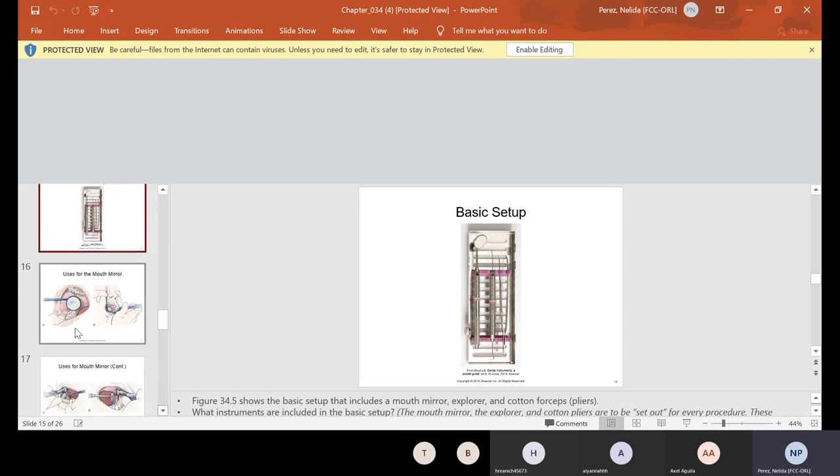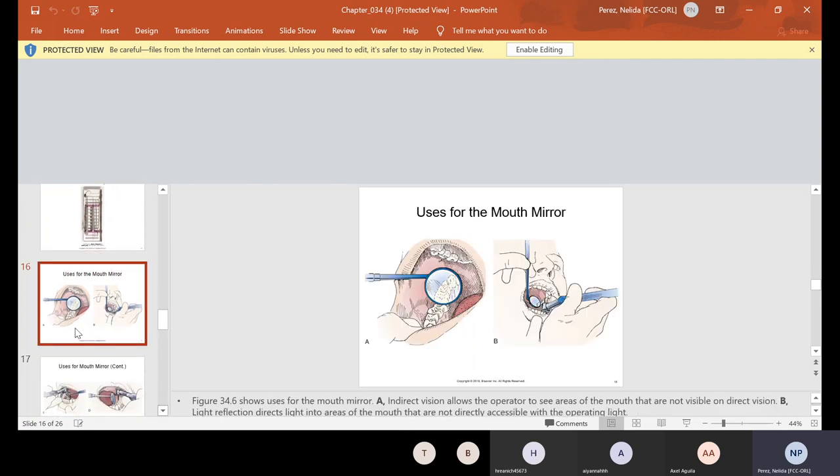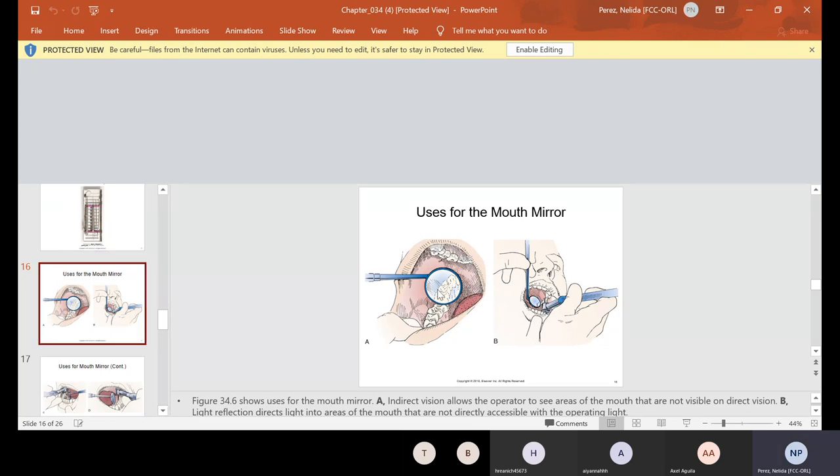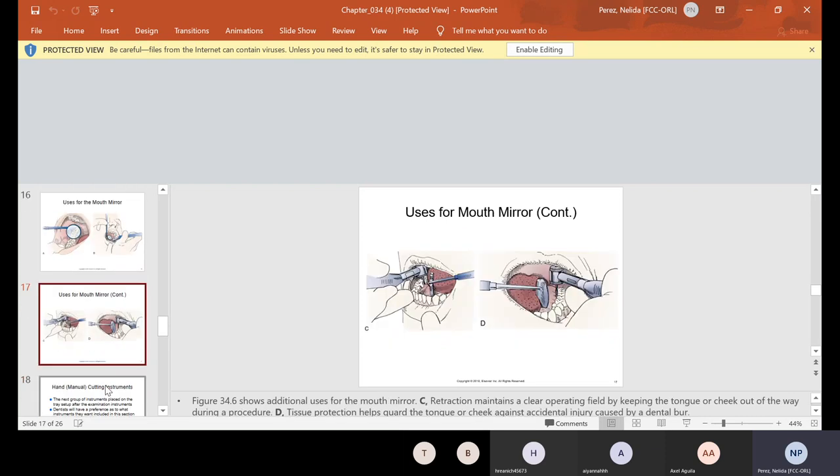And we have it in the lab and we use it all the time. Now, what do we use the mouth mirror for? We use the mouth mirror for indirect vision. So that means that we're using the mirror to see what we can't see, mostly like the top teeth, especially. Sometimes we use it for light reflection because, of course, the mouth is dark. There's no light in there. So we'll use it for that. We'll use it also for retraction, whether it's for the tongue or the cheek.